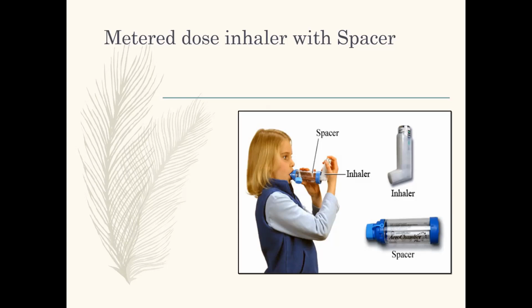We do not want our clients to overuse the medication in their inhaler. If they use it too much, too many puffs, too frequently, they can actually get rebound inflammation. They can get bronchoconstriction, which would be bad because these clients already have trouble breathing, right? They can use a dose counter, which will tell them how many doses they have left in their inhaler.